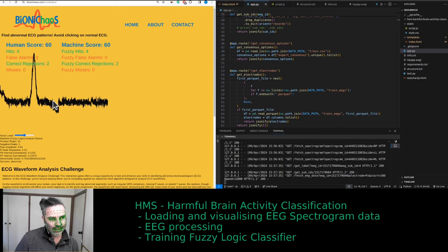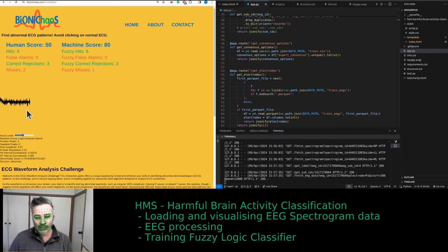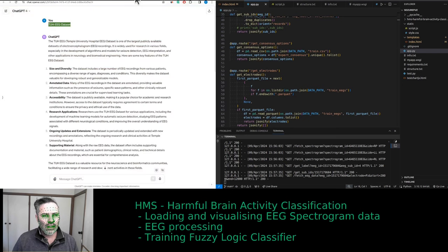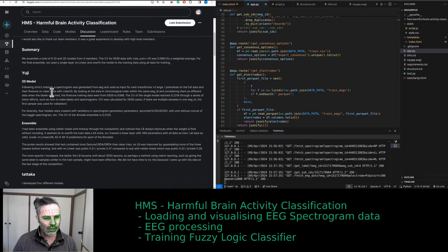You would have your frequency, amplitude. You would have channel interactions. Yeah, this is just assuming a single channel ECG. Noise, we would not be doing much filtering. I assume the signal was already filtered. Even if not digitally, it was filtered by the hardware of the recording equipment. And that data was collected by Harvard Medical School, so it must be correct, right? So must be great quality.